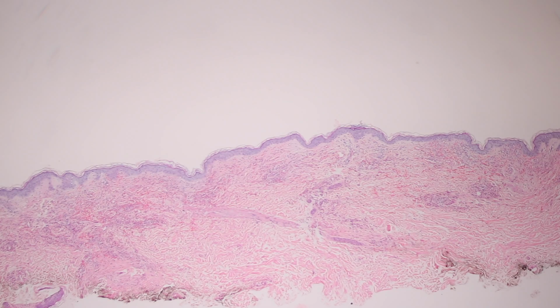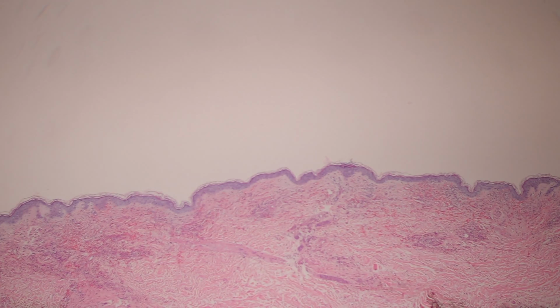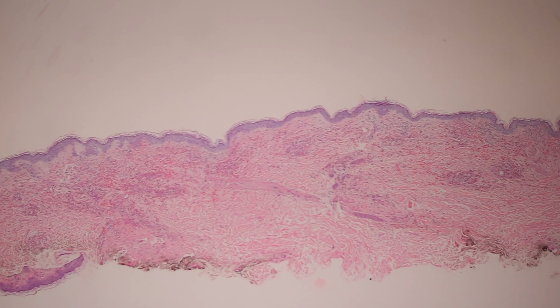So let's go back to lower power for a minute on this case and take note of something. This is a superficial shave biopsy. I'm really having trouble with the light here. Okay. And even though it's a little hard maybe to make out all the details, what you can tell is that the majority of the involved vessels and the inflammation is right up here in the superficial portion of the dermis. We don't really see the very deep dermis, but you can definitely tell that most of the inflammatory response around the vessels and most of the hemorrhage, everything is in the superficial layer of vessels near this, what we call the superficial vascular plexus. And this is typical of leukocytoclastic vasculitis that's confined to the skin.